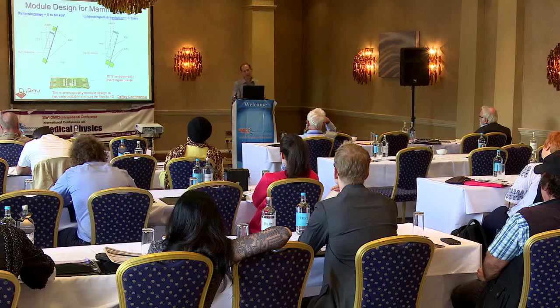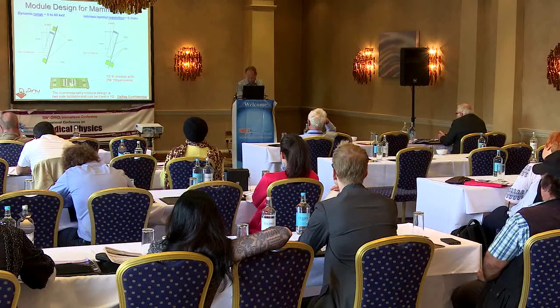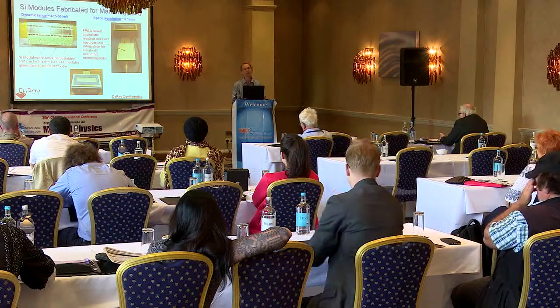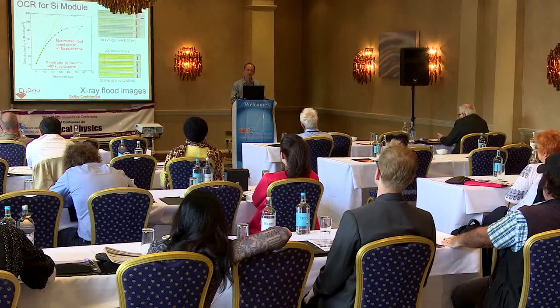And so here you can see a picture of a silicon strip detector with associated ASICs on either side that are connected directly to the silicon wafer by wire bonding. And here you can see an array of these silicon strip detectors that are tiled into a larger field of view.